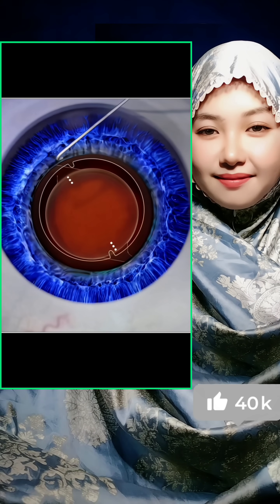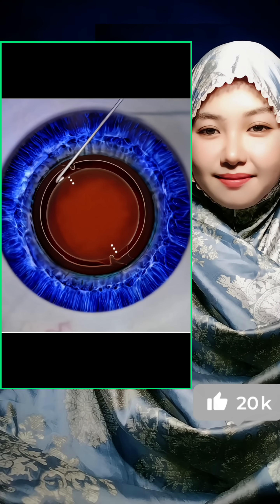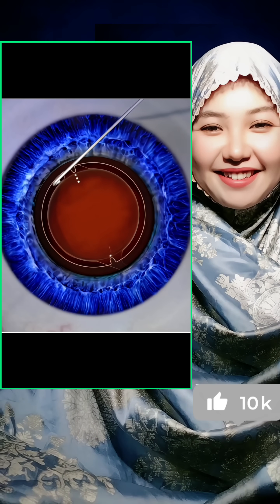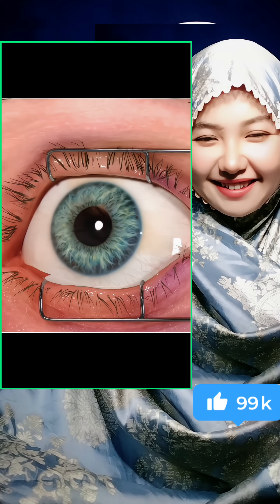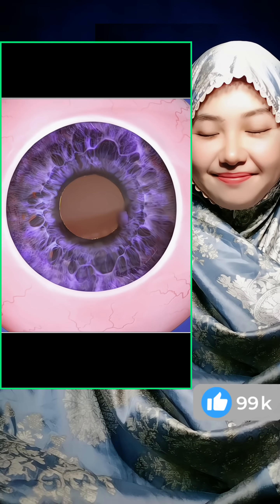The cut is so small it usually seals on its own without stitches. Over the next few days to weeks, the eye adjusts and vision becomes bright, sharp, and crystal clear again.